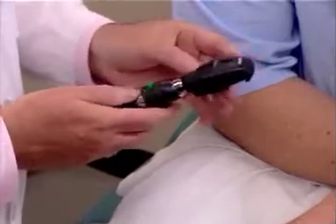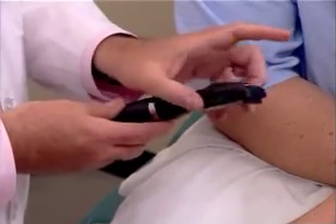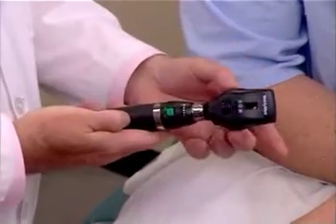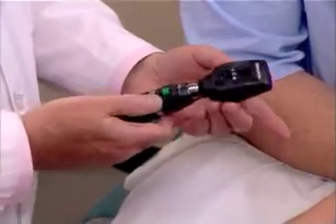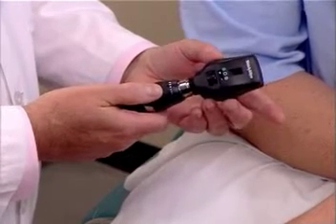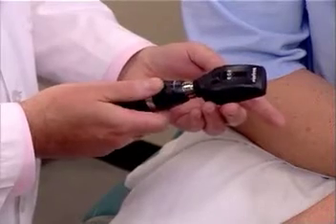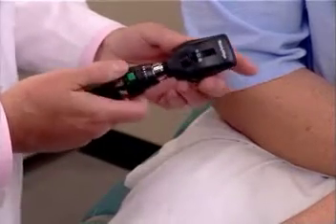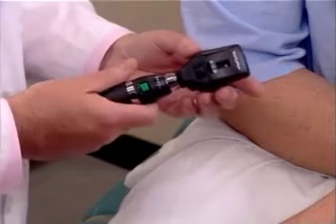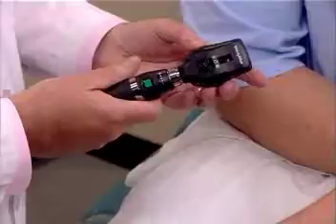A direct ophthalmoscope is an instrument which has a series of lenses which takes into account your refractive error as well as the refractive error of the patient. It's a light source which allows visualization of the cornea, the lens, the vitreous, and the retina. In order to use this instrument, you want to use the instrument held in your right hand using your right eye to examine the patient's right eye.